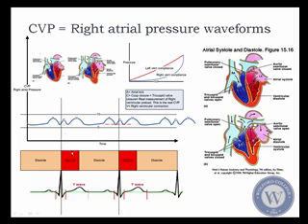Right at the QRS is when you see the end of the A wave and the beginning of the C wave. This is when systole begins. Right at the top of the QRS is the point of systole beginning. So you can always find the C wave as a consequence: just look up from where your QRS is, and that's where your C wave is. The reason that's important to know is that the C wave indicates the point on that pressure curve where ventricular filling is at its maximum. So it really indicates, in this case, the right ventricular end diastolic volume.